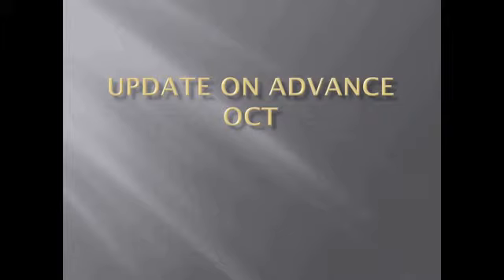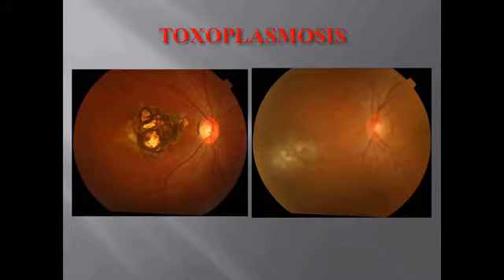So you titrate the burns in the periphery and then bring them to the center in the macular area, and then customize the grid which you like for that particular area of the thickness, and then treat it. So it becomes very easy. It's very fast. The multi-spot allows you uniformity, control, and extremely fast lasering. So this is about the laser, and a few images. You already heard a lot about the OCT, the fantastic stuff.